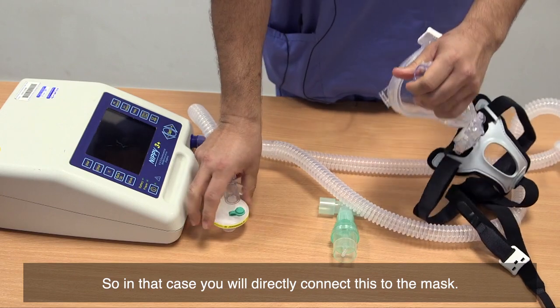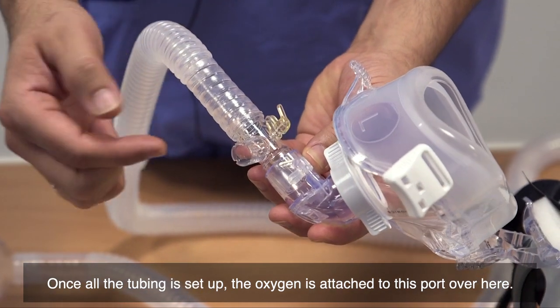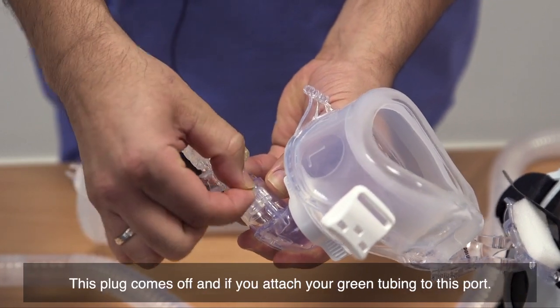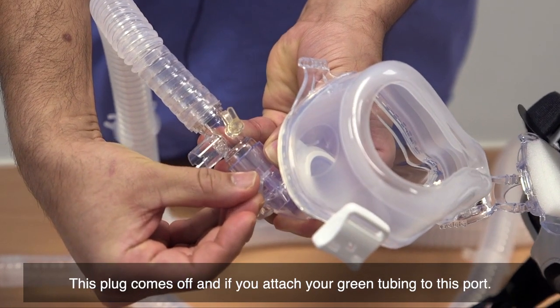So in that case, you will directly connect the tubing to the mask. Once all the tubing is set up, the oxygen is attached to the port over here — this plug comes off and you attach your green tubing to this port.